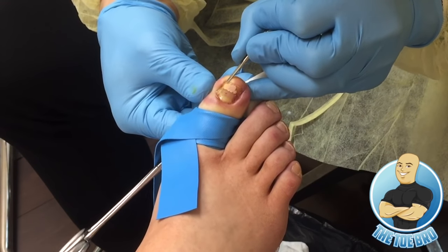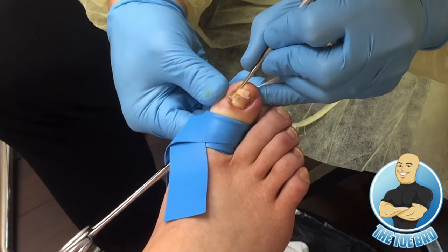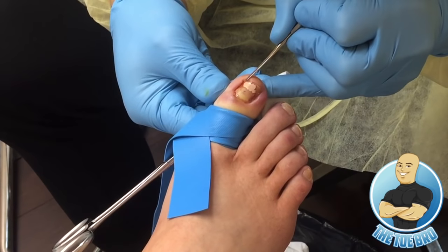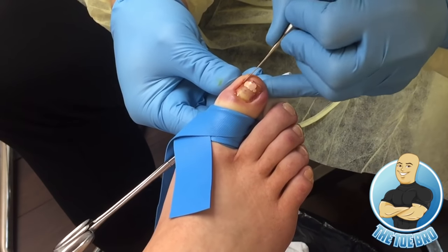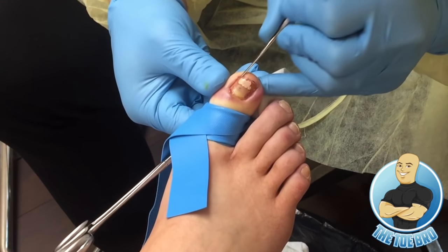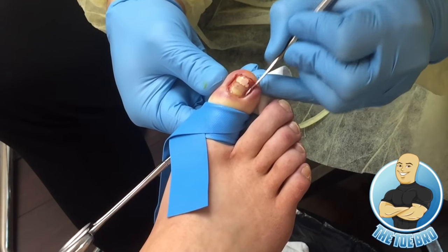We're doing this to reduce the amount of trauma to the remaining nail, and we just want to separate the portion of the nail that we're going to cut back. By carefully separating the nail from the nail bed, we minimize the damage to the remaining nail because we don't want to have the remaining nail removed. We just want to remove the side portions.